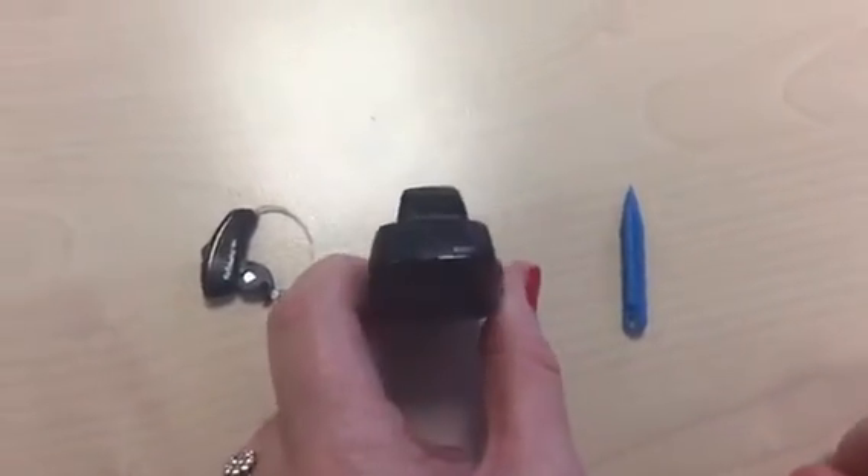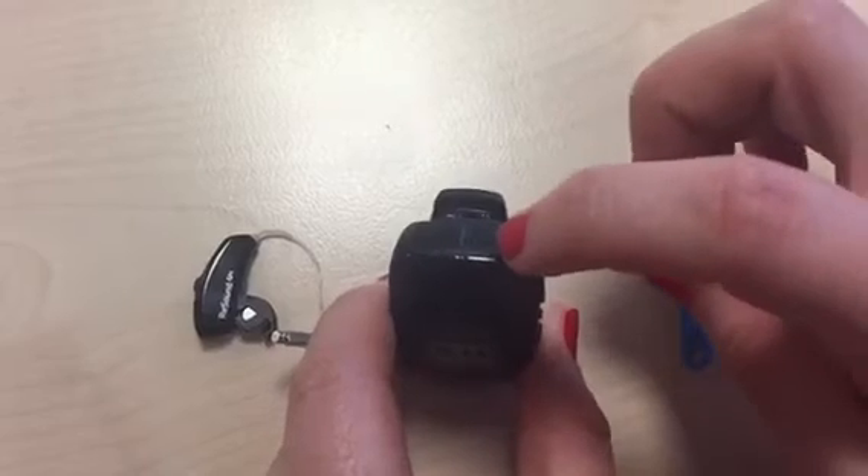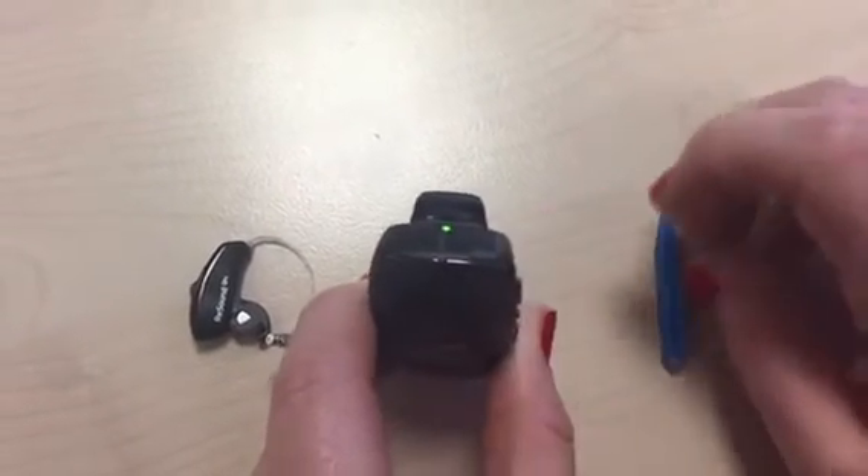Next, turn on the multi mic. To do this, simply press the button at the top for about 2 seconds until the green light turns on.